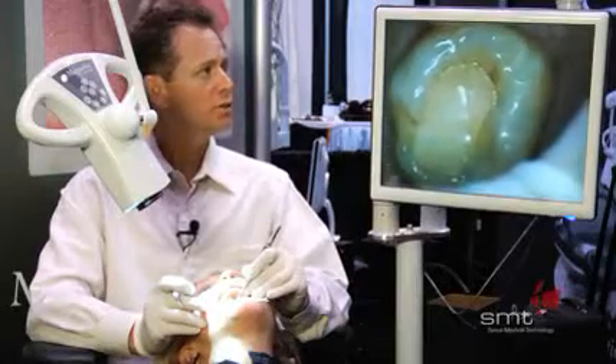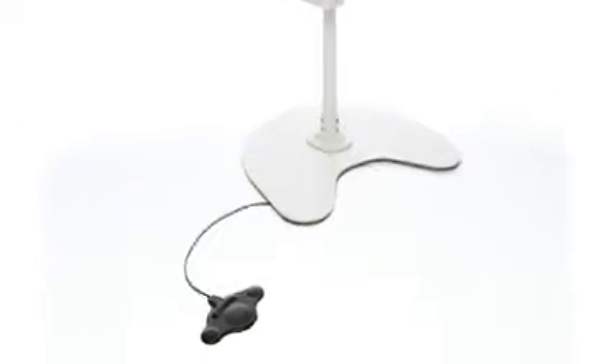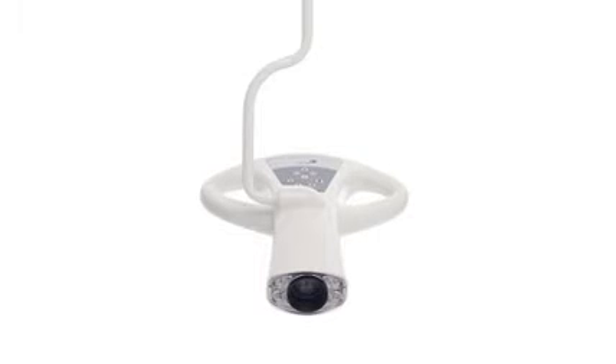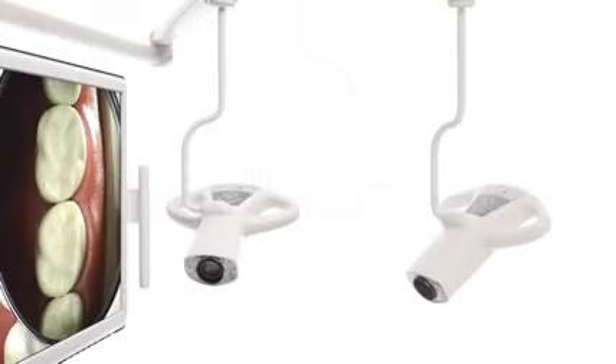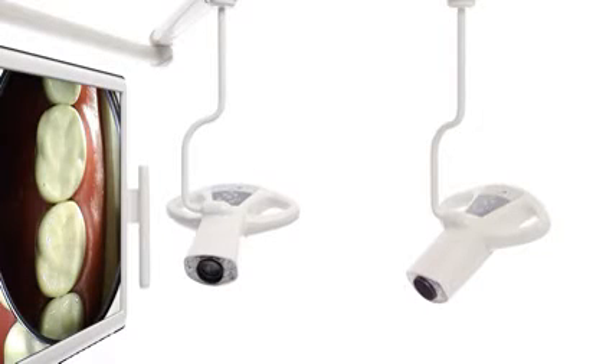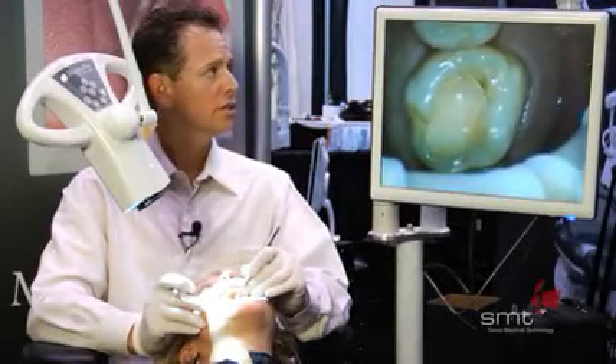With the Dentaloscope 2D, you're able to take before, during, and after pictures using your foot pedal. You can hook it to a DVD recorder and record your entire procedure. You can connect it to your computer software and input these images into your software programs. It's just very, very useful as far as diagnosis and as far as treatment.